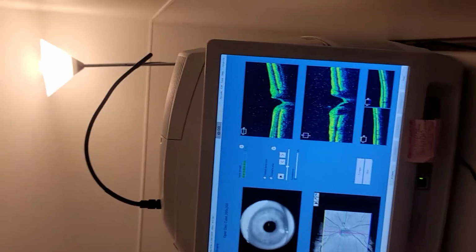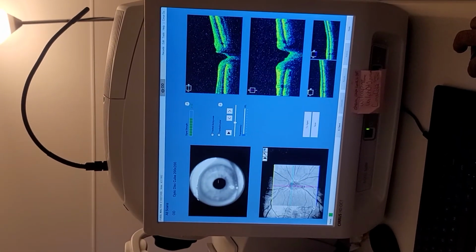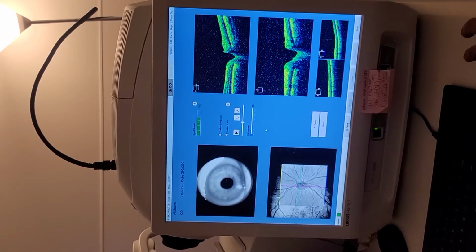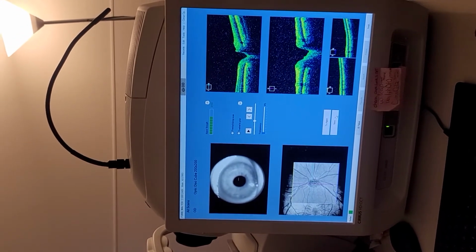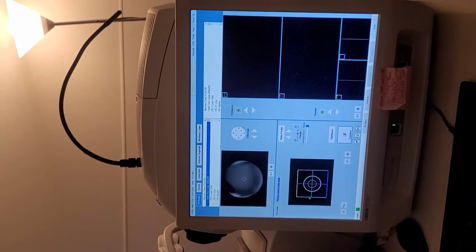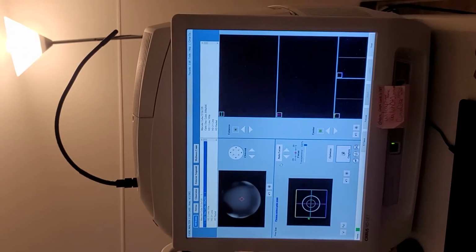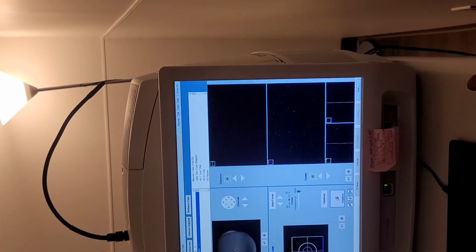Okay. Get the best that you can. So that image should have been more in the center too, but it's okay. I would save that. Save it. But you would want it actually to be more in the middle of the screen. It takes practice to figure this out, you know. Finish.